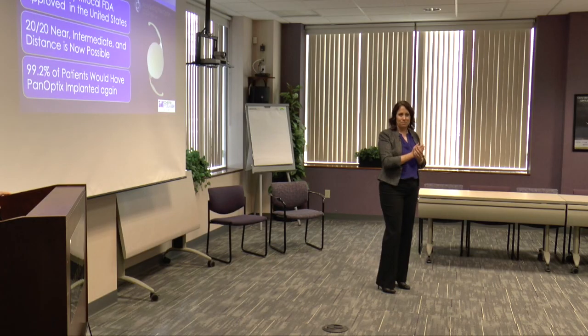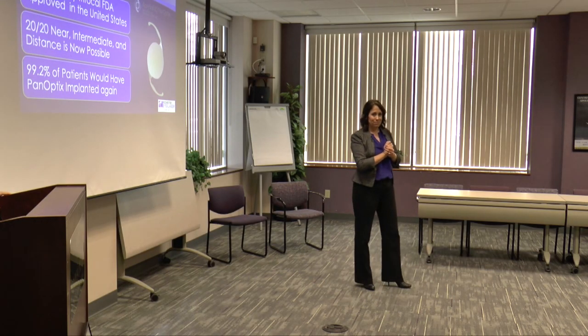Same concept, but those are excellent questions because people will often say, geez, I don't really tolerate progressive lenses that well. Here, the lens does all the work. You don't have to adjust your head. So if we get a patient to see well at distance with the lens, which I usually call 20/20 to 20/25, then the lens is going to do what the lens will do.